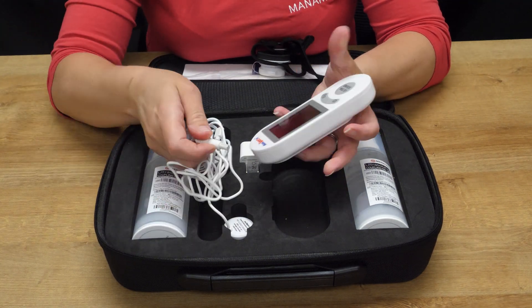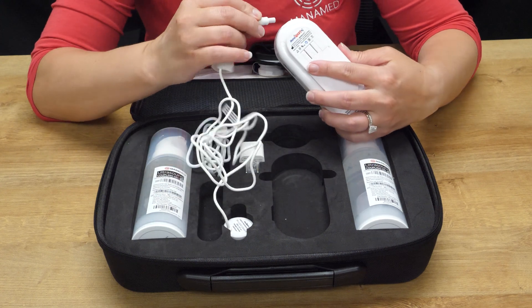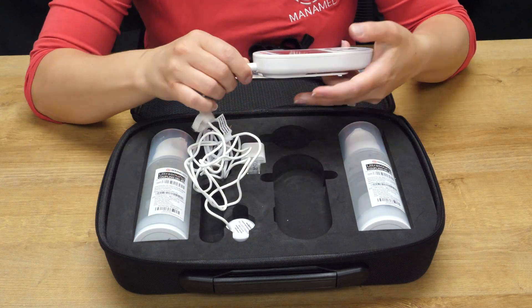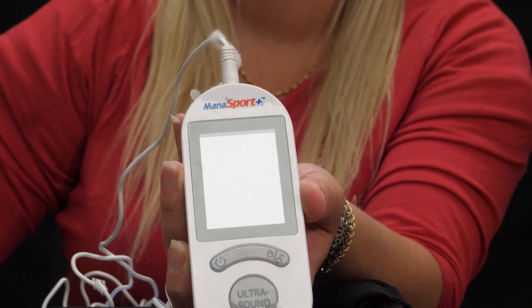The first thing we're going to do is connect the transducer to the ManaSport. Gently place it on the top of the ManaSport and the unit is ready to use.